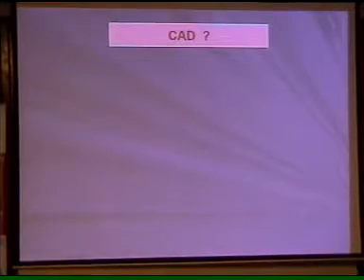Now, what ETT gives you is, you have a suspicion in mind of coronary artery disease.